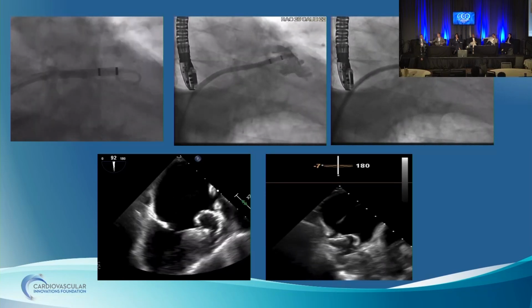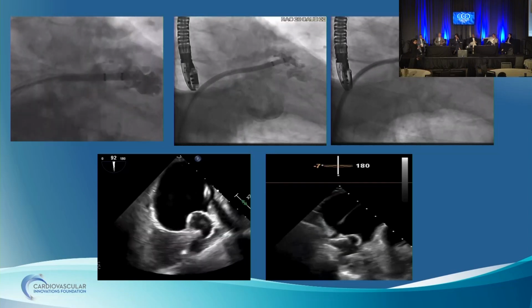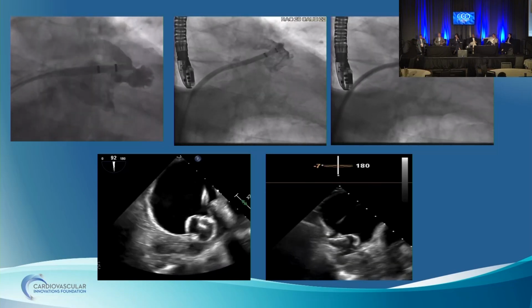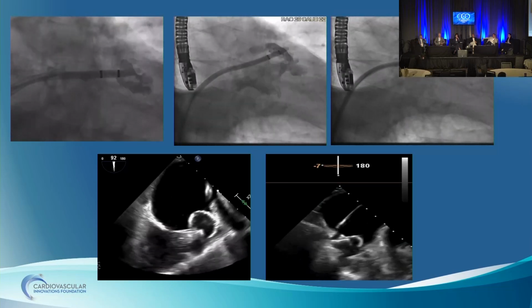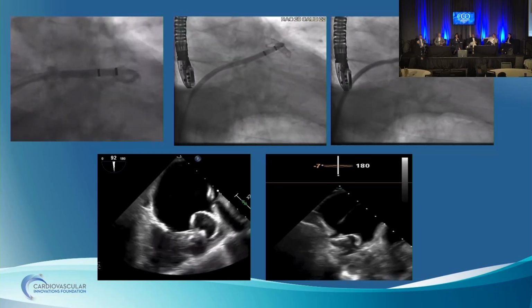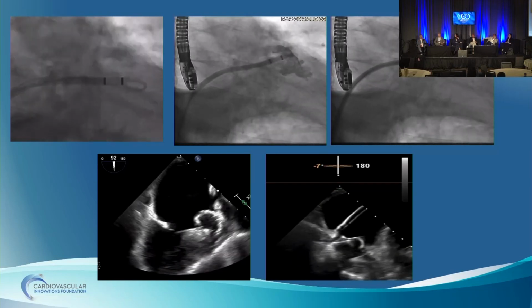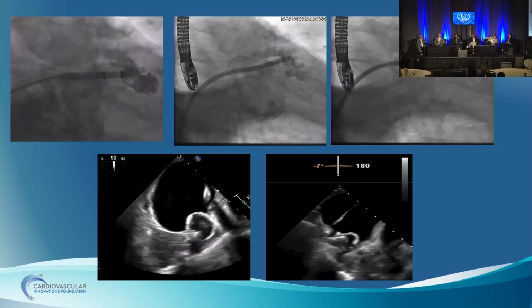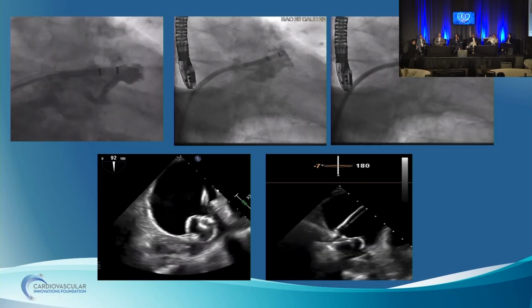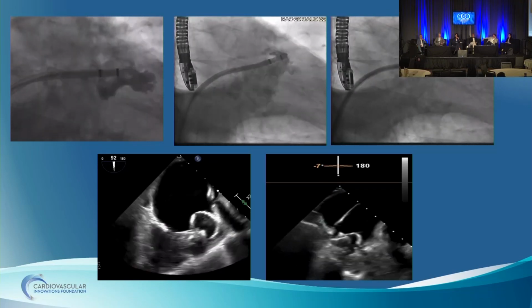Well, in the angiogram, you can see the anterior wing very wispy, right? It's coming up. So this sheath is actually pointed initially posterior, and you just can't make that turn. For a case like this, you want to be as inferior as possible. And that's part of the challenge, right? Because your fossa is tiny in the middle. So you've got to get hyper inferior for this to work, or you would use the TruSteer sheath.